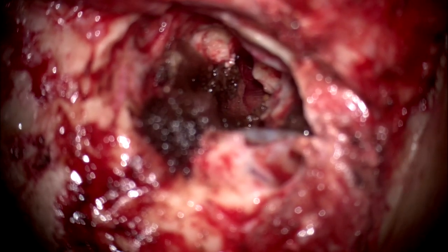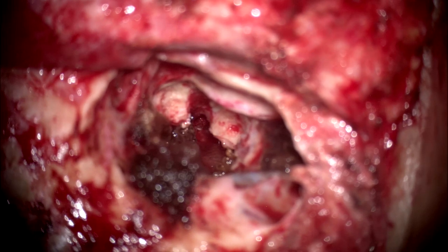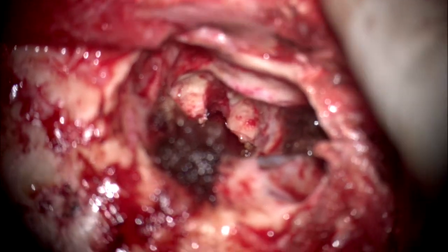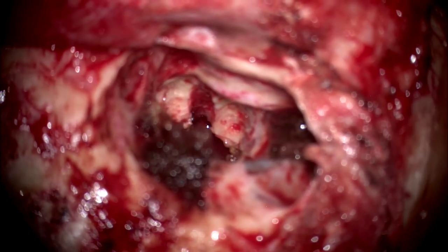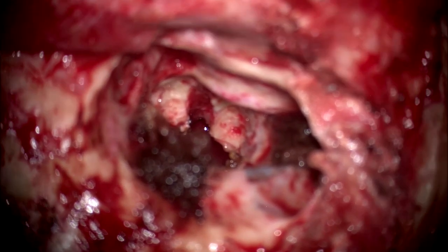So now we'll pack the cavity with long pieces of fat. The fat plugs will prevent the CSF from coming out. Yes, the entire tunnel has to be blocked, long pieces. Okay, sir. See now, first a small piece for the aditus, a small piece of muscle or anything. Give me a knife. See the CP angle, absolutely dry? Yes, sir.